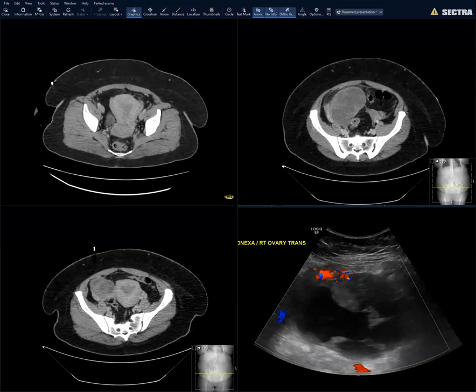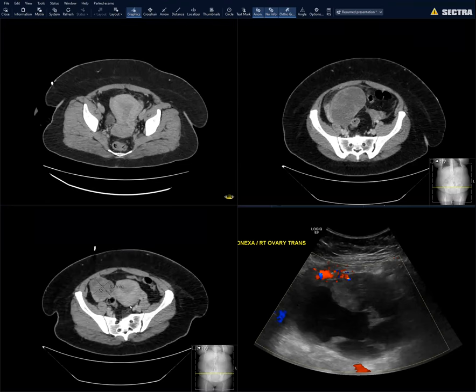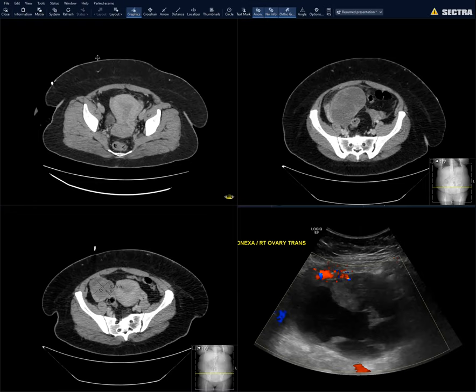This looks really rapidly growing — is it usually this aggressive? Usually not. I wonder if superimposed infection occurred at some point. Interesting case, thanks Josh.